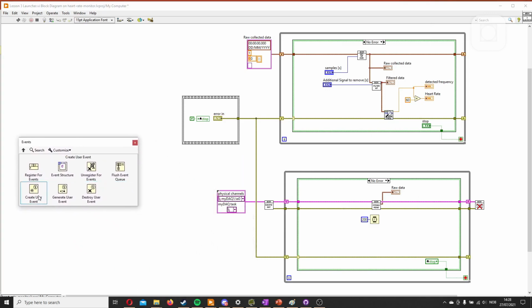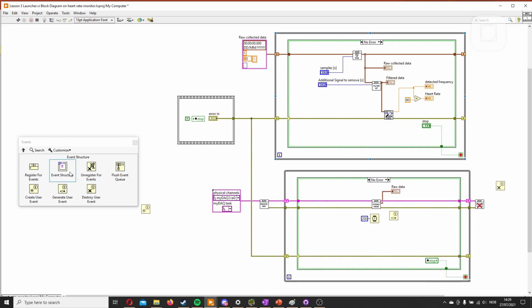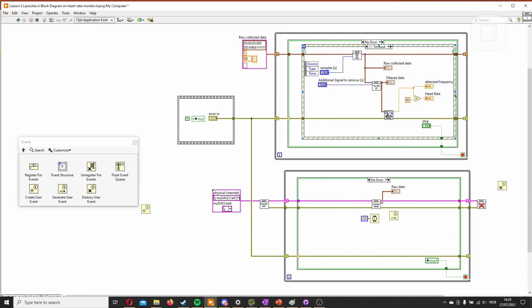So to create a user event, we need the create user event. And to generate, to send it, we need to send it here. So we send the data in here. And then we need to destroy the event. And to receive it, we need to do something else. We'll make a little bit more space here. We will need an event structure. We'll gather this around everything in our code. And now this is in the timeout structure. You can see that here, which means every time it times out, which will be never since we don't have any input here. So this is the wrong event, but we'll fix this later.